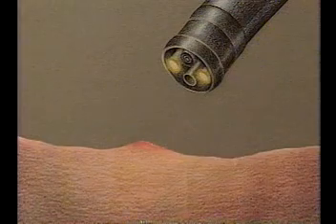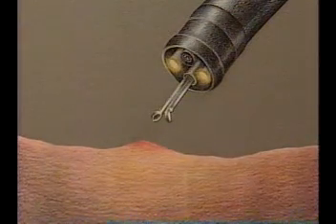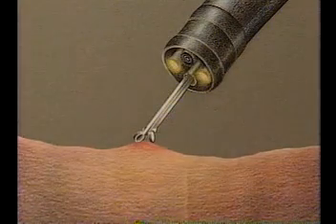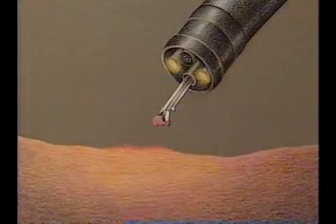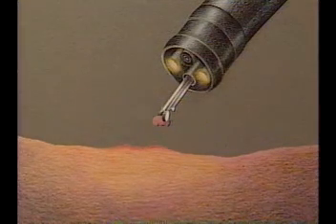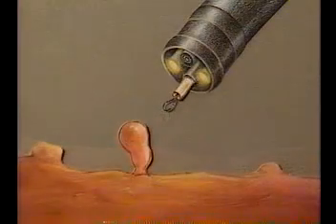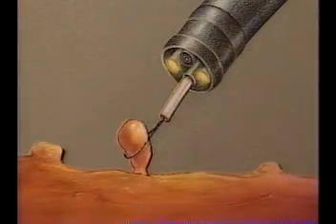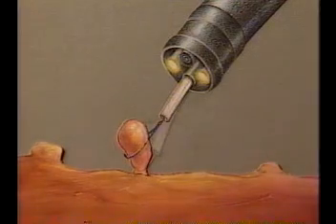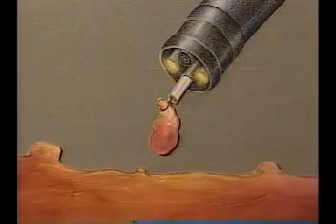If abnormalities are found, an instrument can be inserted through a channel in the colonoscope so that a biopsy or tissue sample can be removed for later laboratory analysis. There is no sensation inside the colon, so when tissue is removed, you will not feel it. If polyps are found, a special instrument can be inserted into the colonoscope and the polyps can be removed. Prior to the development of the colonoscope, only the largest polyps were removed, and they had to be taken out surgically.